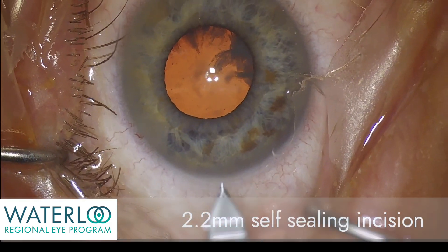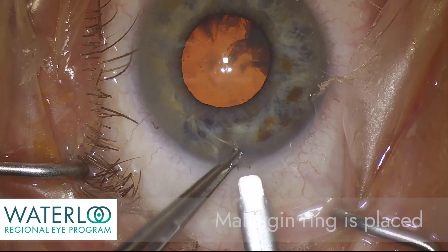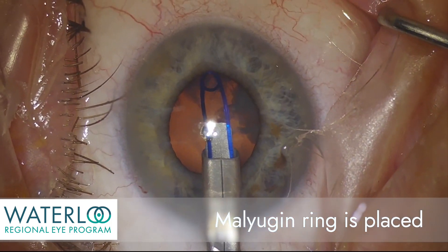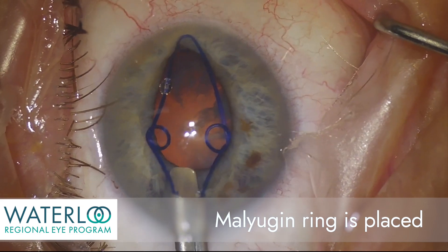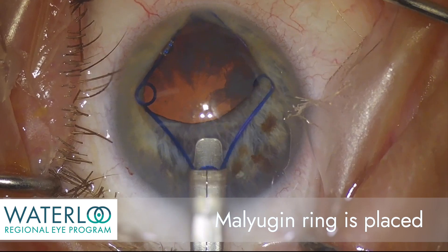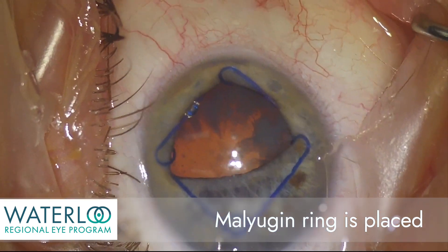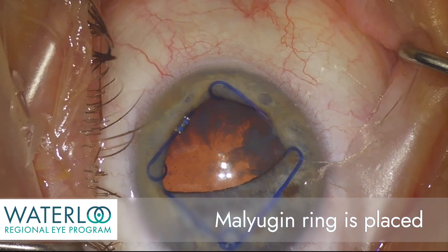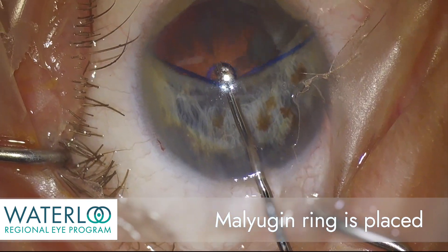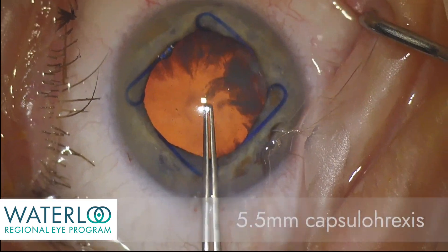A 2.2 millimeter self-sealing incision is made and the malyugan ring is now placed. The eyelets of the malyugan ring capture the edge of the iris in four positions to create a stable 6.25 millimeter pupil diameter. Here a malyugan manipulator is used to secure the final eyelet of the malyugan ring, keeping the iris stable throughout the surgery.